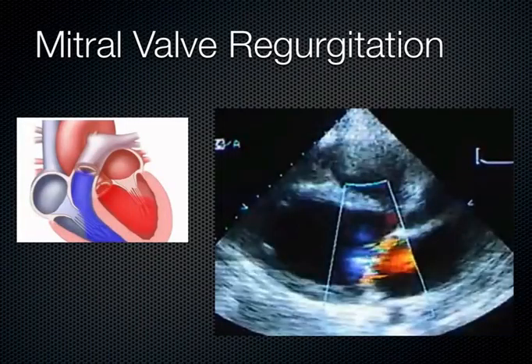But with the heart, we can use Doppler to evaluate the valves. This is an example of the parasternal long axis, just to demonstrate where that mitral valve is. One of the things you've got to remember about Doppler, and it's a little confusing initially, but you have to commit this to memory, is that when you work with Doppler, you can't have the Doppler assessment at 90 degrees to the angle of the sound.